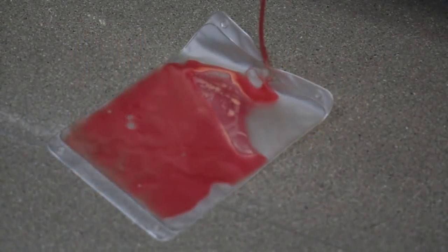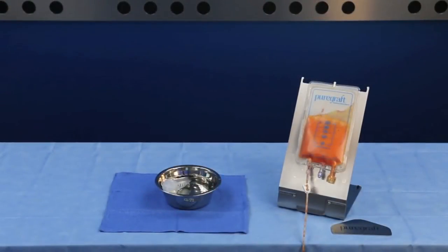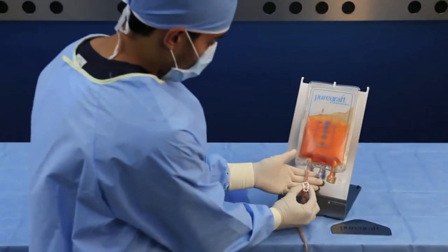As draining slows, note the amount of fat in the PureGraft bag. This is the pre-wash tissue volume. Use this number to gauge how much lactated Ringer's is needed for washing. After excess tissue has been drained, close the clamp to the drain bag.